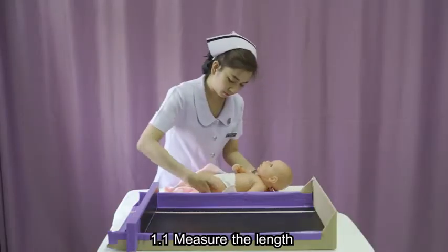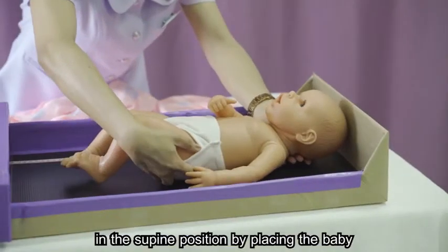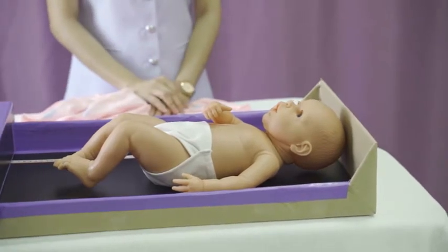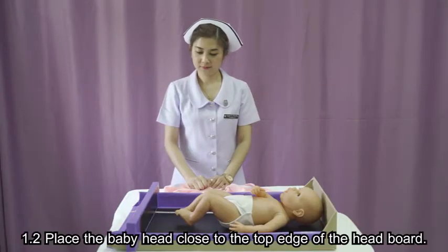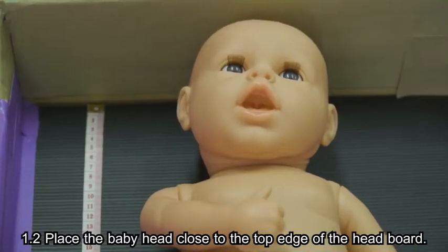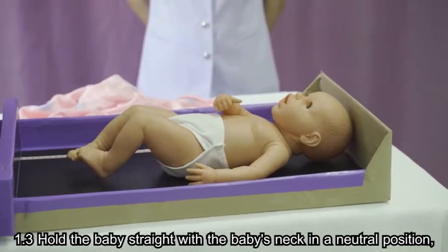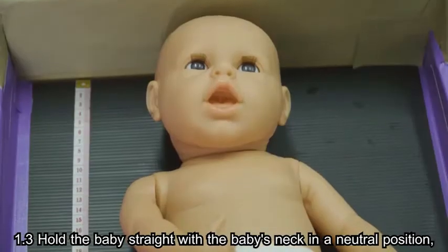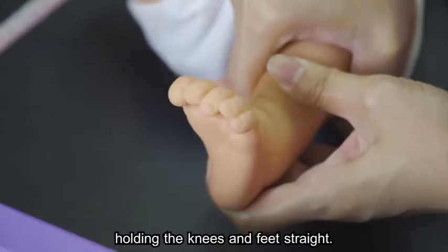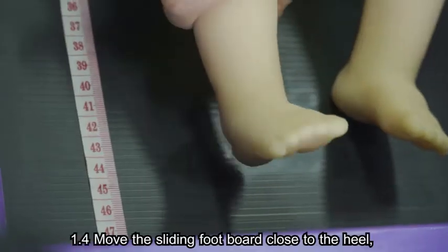Measure the length in the supine position by placing the baby on the length measuring device. 1.2. Place the baby's head close to the top edge of the headboard.